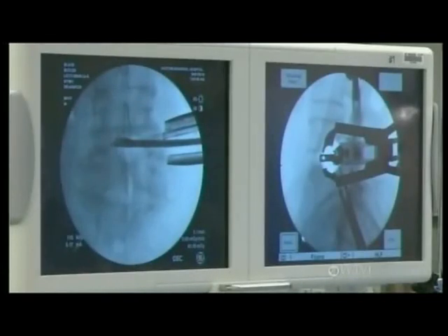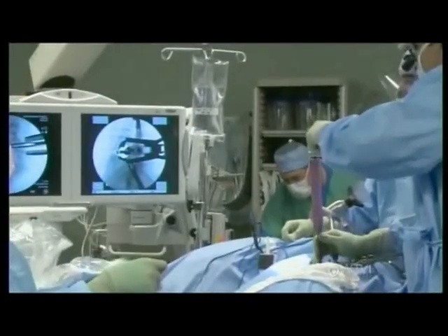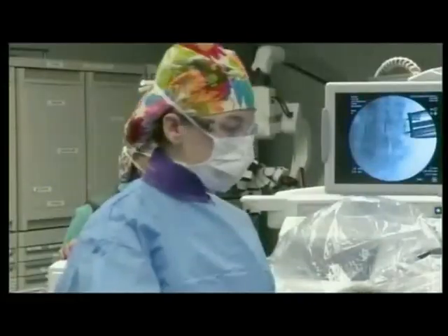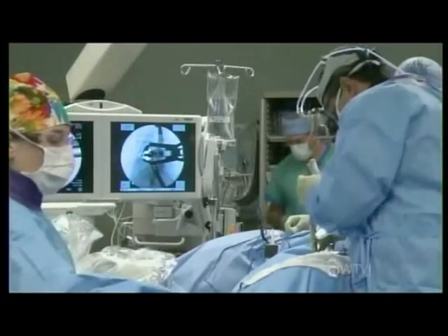We'll be able to remove the disc in and of itself — that's right. Looks good here, but we want to make sure it looks good down at the foot of the bed. Orientation looks good here. This is just kind of cutting the disc itself as well.